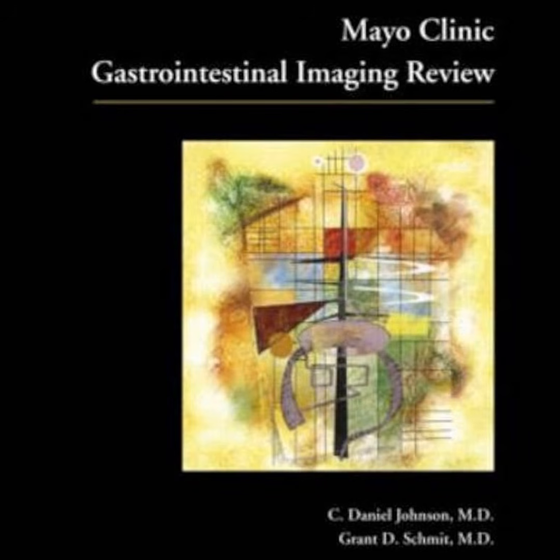But the text also categorizes two idiopathic mimickers that are really interesting: eosinophilic gastroenteritis and Menetrier disease. And with these, spatial awareness within the organ itself is your major clue. Right, geography inside the stomach. Eosinophilic gastroenteritis is characterized by this dense eosinophilic infiltration of the mucosa and submucosa. And radiographically, it heavily targets the gastric antrum. So the lower portion of the stomach. Yeah, and it also involves the small bowel, producing this diffuse or segmental nodular fold thickening. So if you see a lower stomach stricture combined with small bowel nodularity, that points heavily toward an eosinophilic infiltrate.